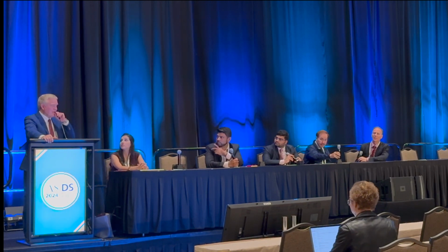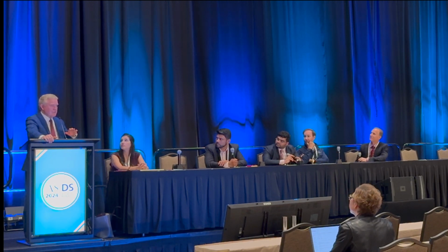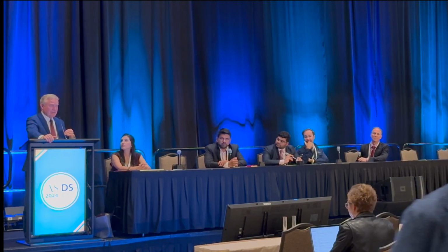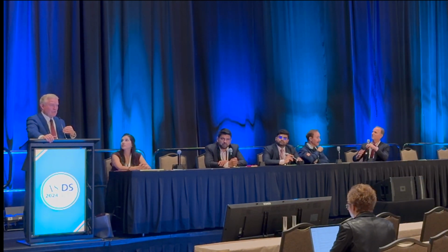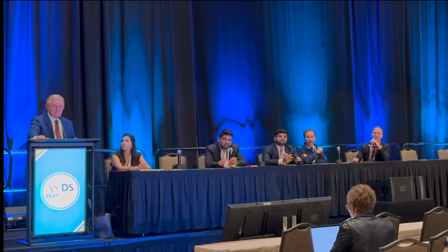One comment I have is that with full ablation, once I see the dermis, I don't want to keep heating the dermis and trying to go deeper. But I will often add fractional ablative laser to some of the more difficult areas with a few passes. You don't want to be super aggressive with both full ablation and fractional ablation, because then you could get hyperpigmentation or make scars worse. If you want to go deeper, consider adding a few passes of fractional to your full ablation.